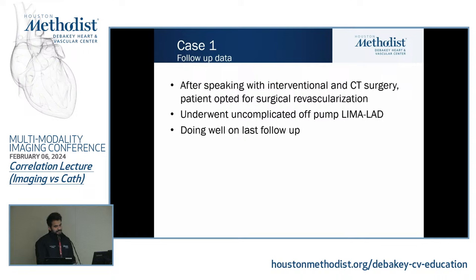Hey, I'm not making these things up. The interesting thing was he actually underwent an uncomplicated off-pump LIMA to LAD, and he's alive as of the end of January. Now, the ejection fraction on the repeat echo somehow came up at 60%, that I don't quite know if it's real, but. So all the decision was made without ischemia. Yes. FFR is not ischemia, it's a pressure drop.